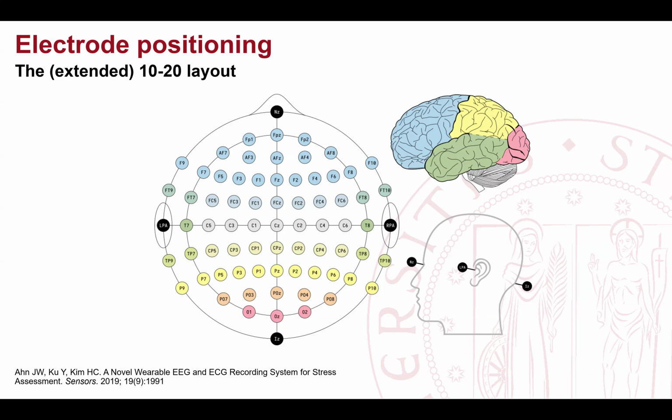And since this activity is mostly present in the central part of the brain, if they measure the activity of, for example, FC3 with respect to CPZ, what they will have in common is exactly this wave, the one related to walking. So by subtracting CPZ from FC3, what I'm subtracting is exactly this common component.